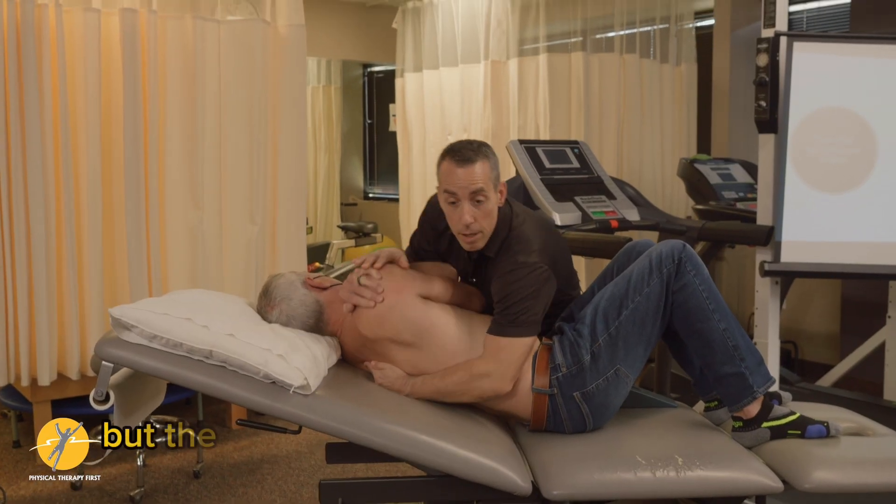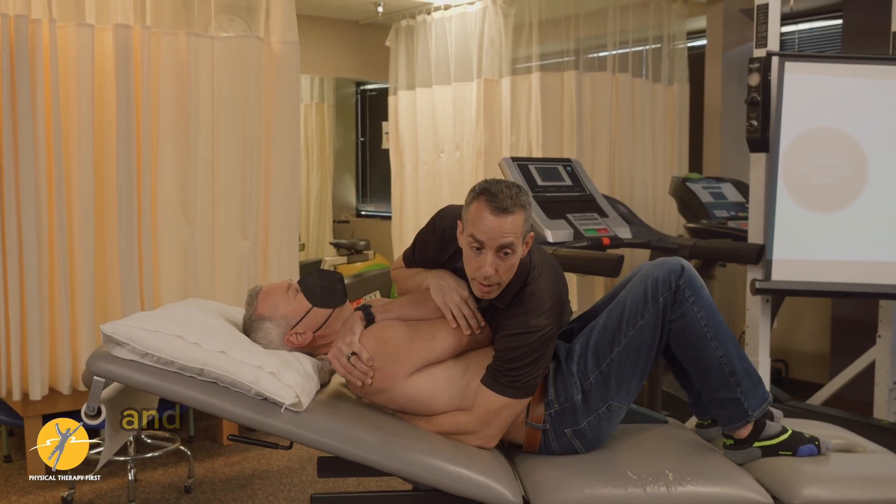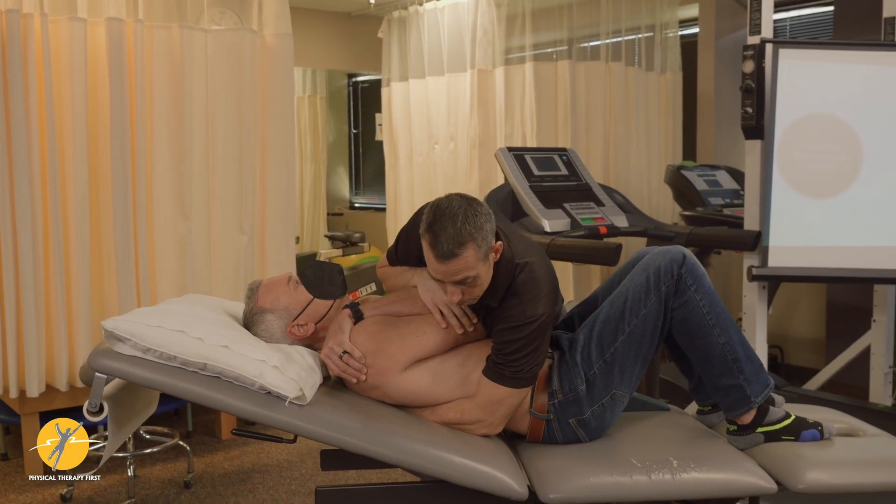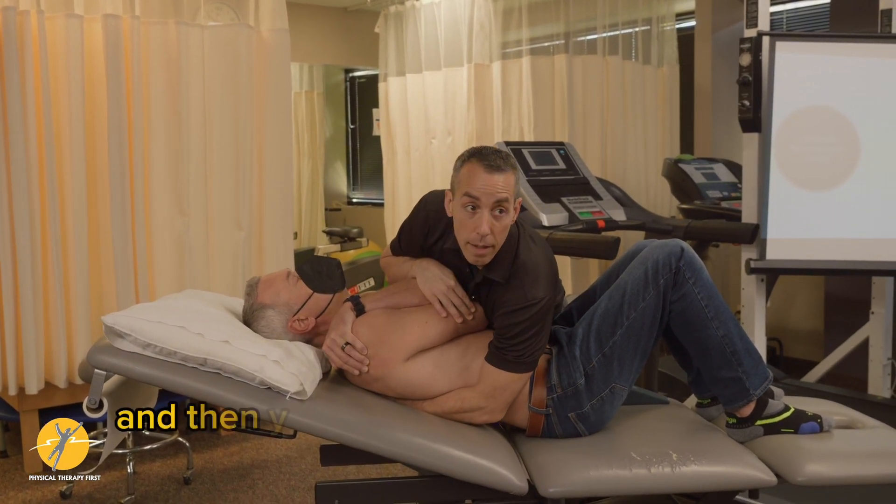The setup would be the same, but the patient doesn't have to sit up as far and you can get to the end range better. Breathe in and out. And then you can get it that way.